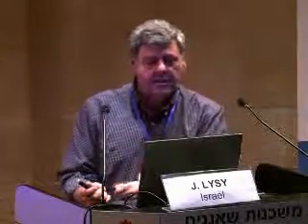What about follow-up after resection? Here we have only comparison to CT, and EUS was found to be superior for assessing recurrence after resection. The sensitivity of EUS for detecting recurrence was higher in two studies, about 100% in both studies compared to 82-85% for CT, and the authors used the possibility to do FNA to increase their possibilities.